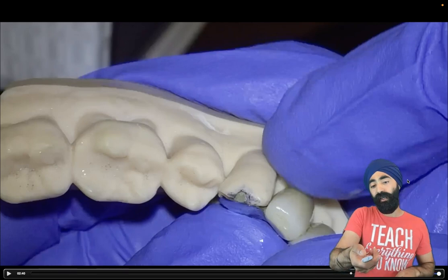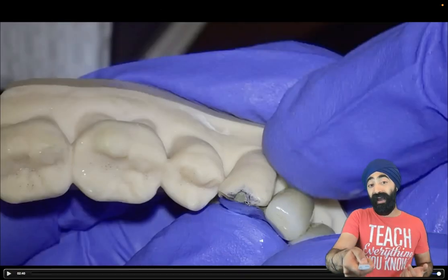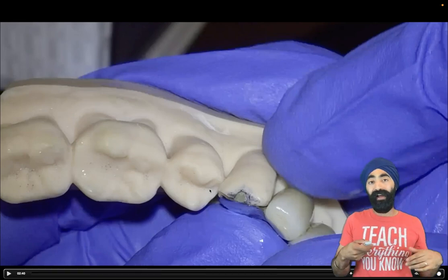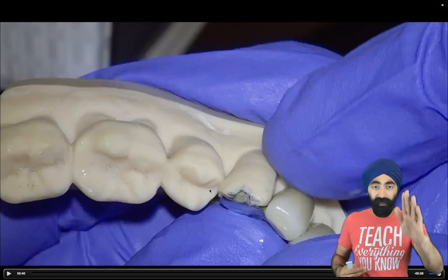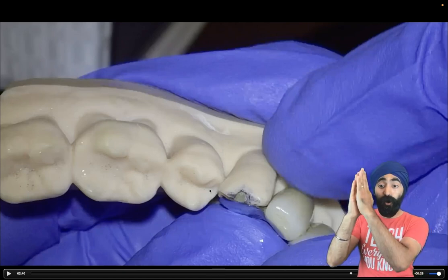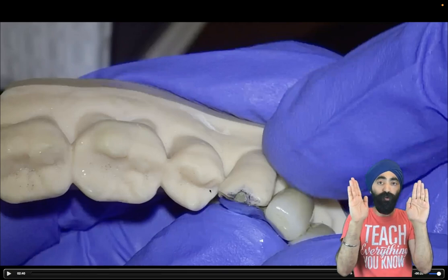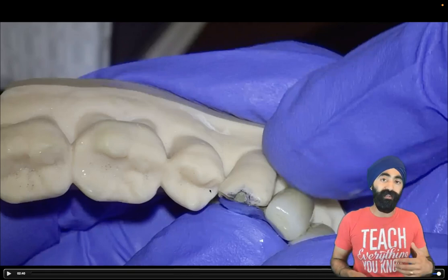Now, just to point out — there was actually some miscommunication here. You see how there's a seating lug? I actually didn't want that. I wanted the bridge to continue all the way along, covering half the surface of the canine — half the incisal table of that canine. I think that's a really good feature to have with resin bonded bridges, because when you're loading the pontic, instead of the forces causing slippage of that retainer, the retainer has something to grip onto. That actually prevents your resin lute from experiencing shear stresses. So it's a good thing to have the retainer cover over the abutment tooth.